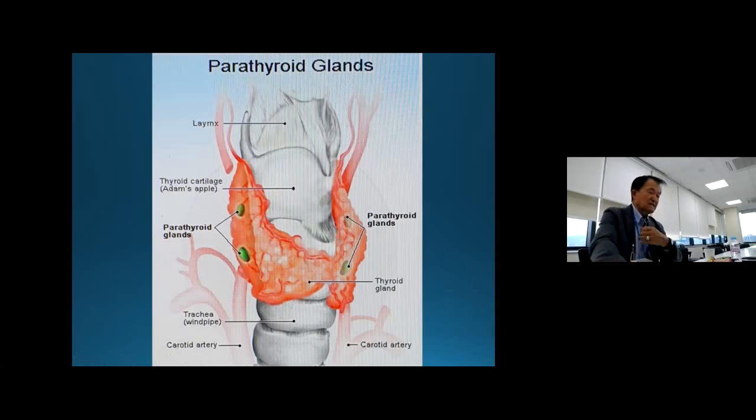In the old days, without this kind of information, they usually spent at least 1 hour, but most often 2 hours, to find this parathyroid adenoma. So locations. In the old days, we would say, oh, probably right side, and probably upper or lower. That's not helpful nowadays for surgeons to find the parathyroid adenoma within a 1 hour period.